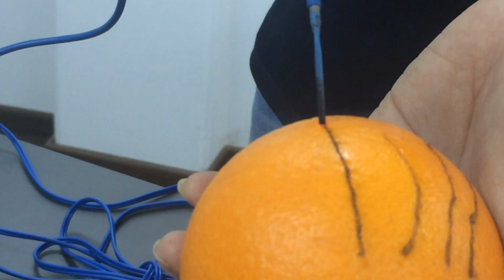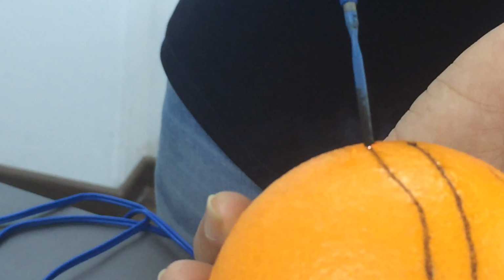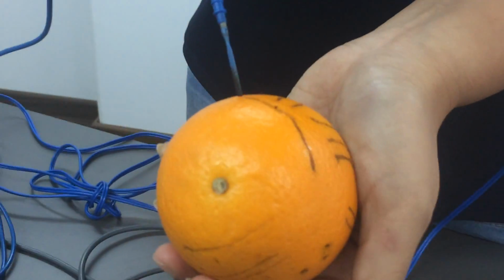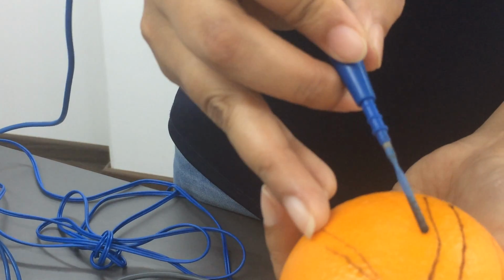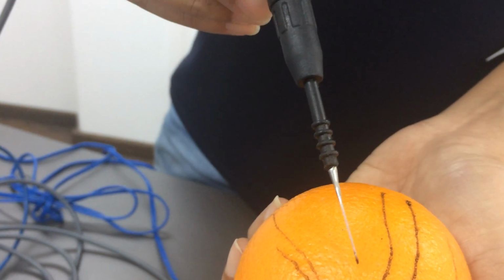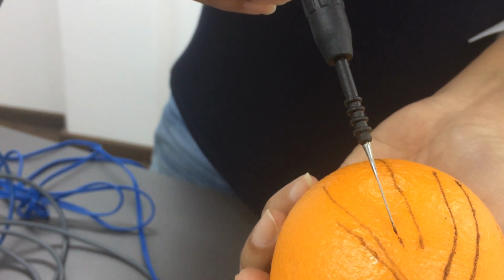Then we use the coagulation mode, which is set at 25 watts. I will use the cut once again. If you can see, the cut always has lesser charring than the coagulation mode. I will use the foot switching pencil now. I am going to use the foot switch to cut the orange and then to coagulate the orange.